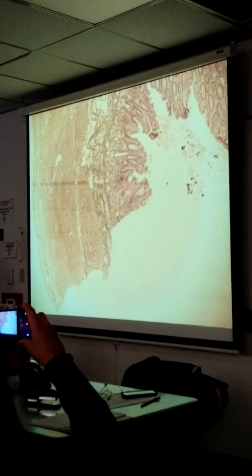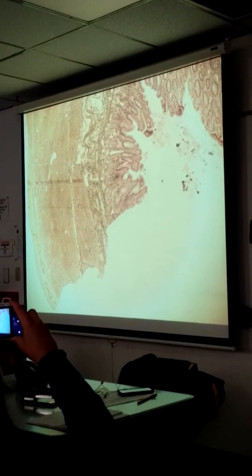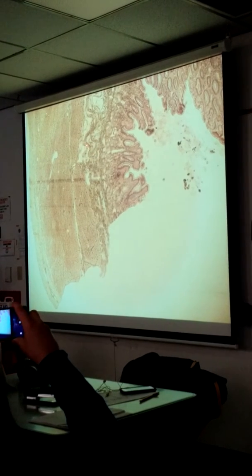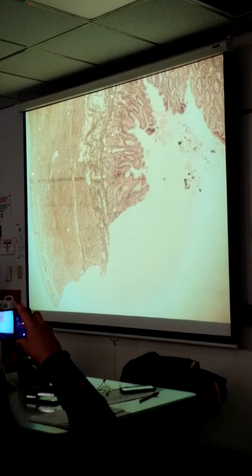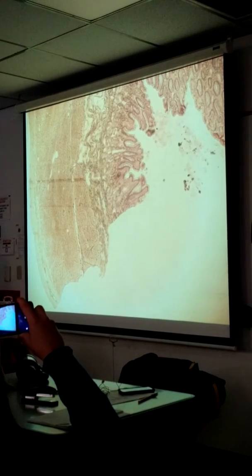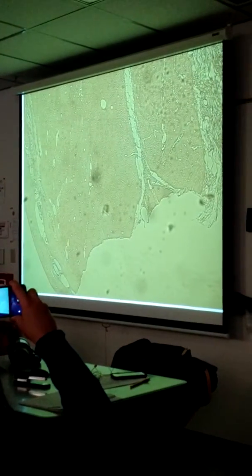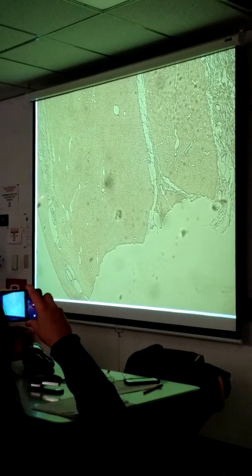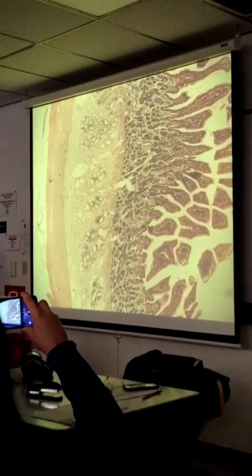Same thing. Here we see all the layers. Here to here is mucosa, with the gastric pit, the gastric gland, and muscularis mucosa. Here to here is submucosa. Here is the oblique, circular, and longitudinal layers of muscularis externa. I don't see serosa on here. Gone. This is just muscularis externa of the stomach. Again, the three layers, oblique, circular, and then this one longitudinal. Okay, that's still stomach. Moving on from stomach to duodenum.